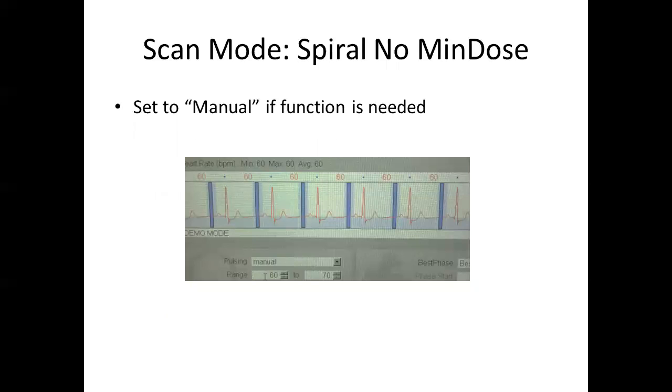You get an idea right in the beginning of how they are when they come in and you've given the beta blocker already. IV metoprolol actually doesn't help much. So we usually know after we've given PO what the heart rate's going to be and whether they're having ectopy. The final call we'll make is after we've given all the IV and the tech's getting ready to scan, and then you look at how stable the rhythm is, and then you make the call. Usually they just do it. For challenging patients, they'll come get us, and then we make the call.